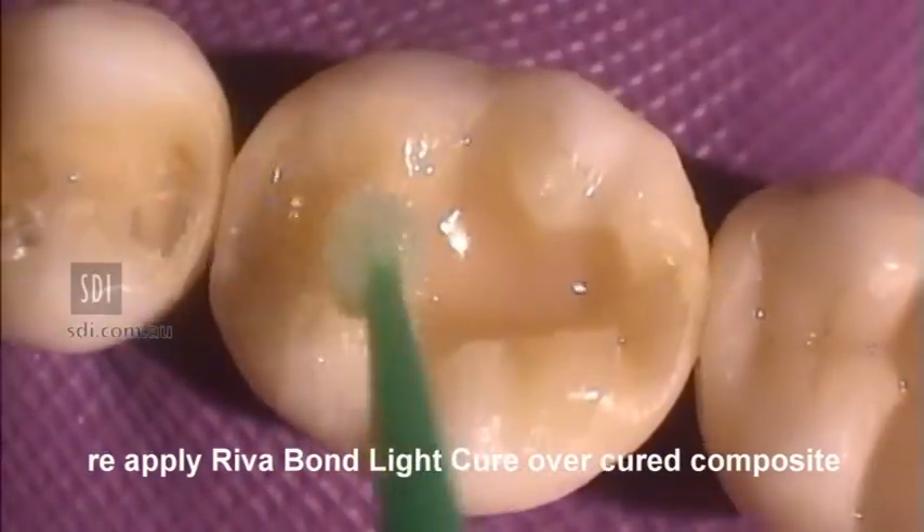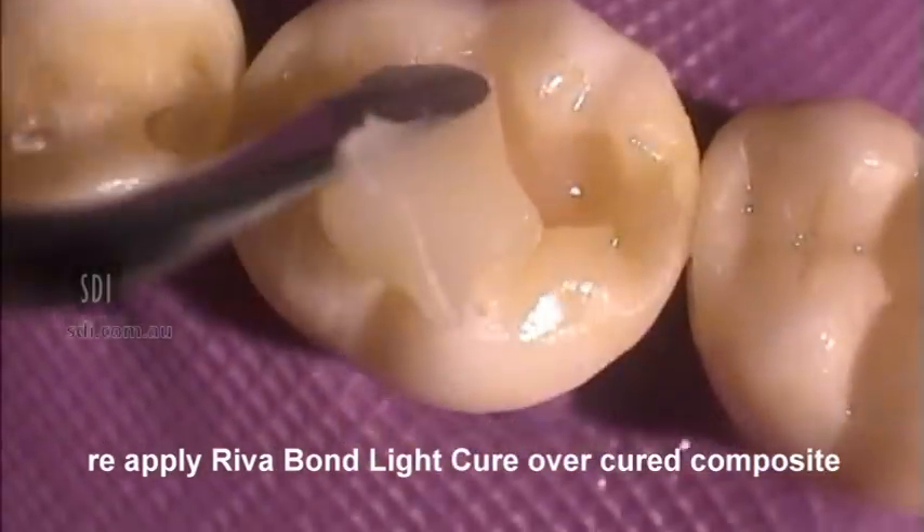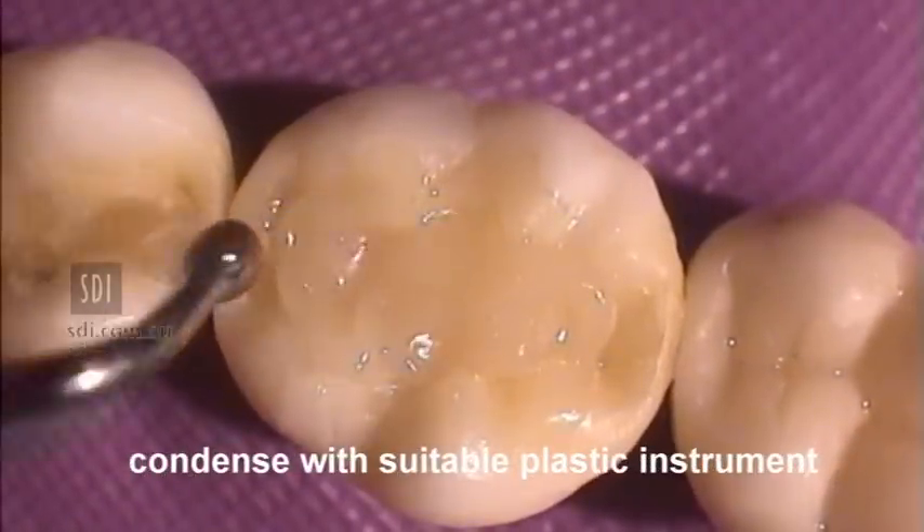If the preparation is deeper than 2 mm, apply a further application of RevaBond LC and another increment of composite resin. Commence condensing with a suitable plastic instrument.